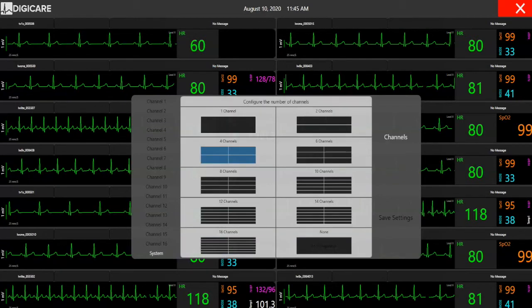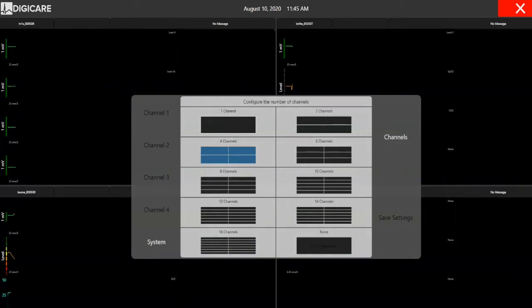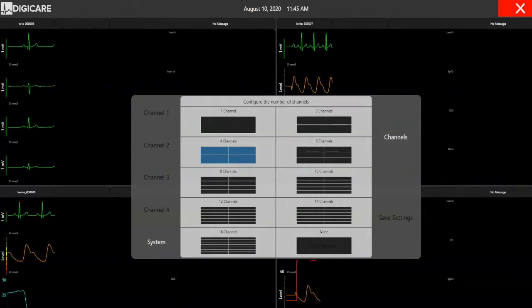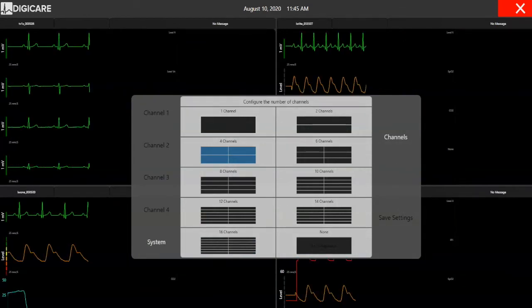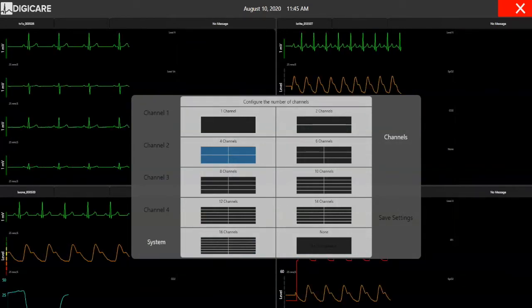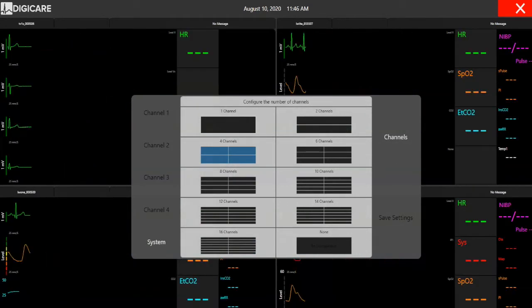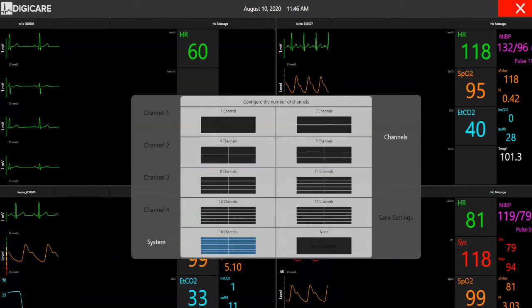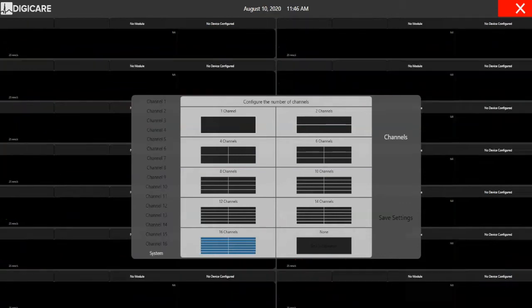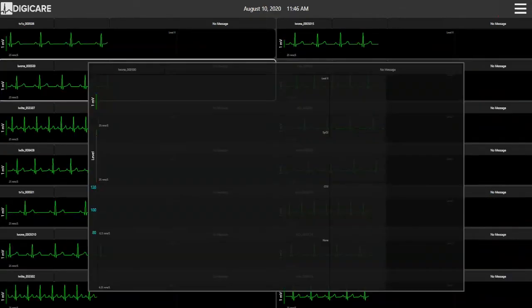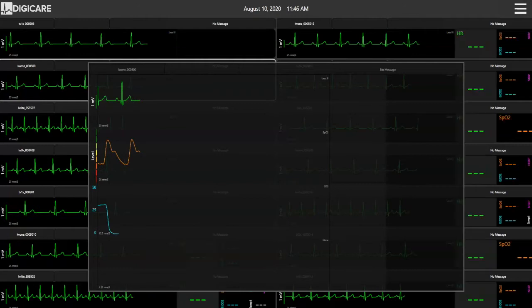The CentralView communicates with up to 16 devices. Users have the option to choose which layout is best suited for them, and you can also zoom into any patient for a larger view.